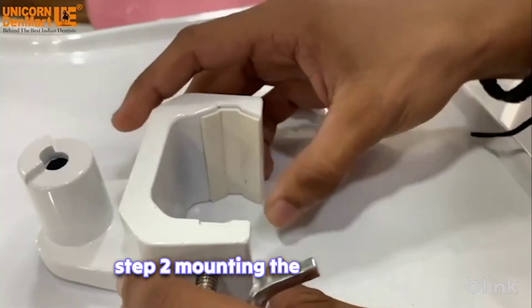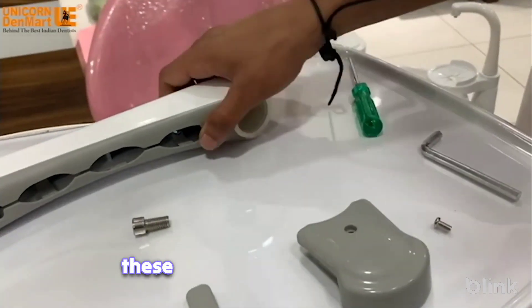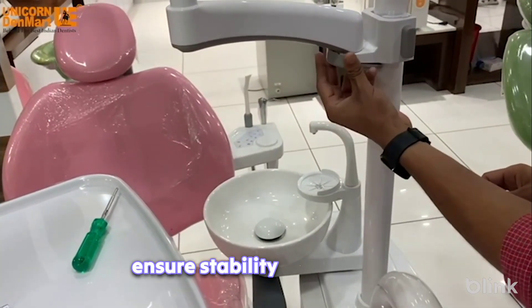Step 2: Mounting the dental chair clamp. Next, attach the dental chair clamp securely to the chair using the provided accessories. These accessories, including the hanging clamp, camera holder, and clamp covers, ensure stability and a secure fixture.